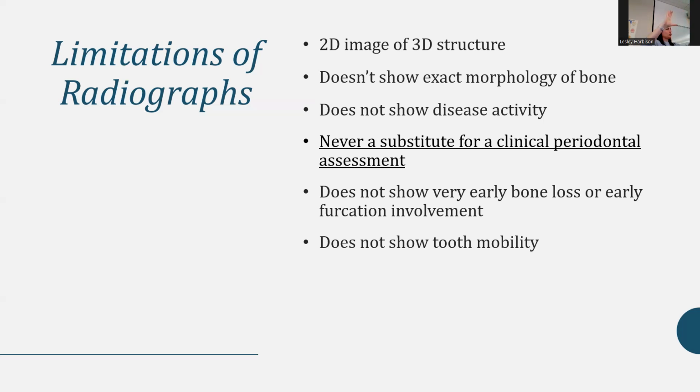You have the crown of the tooth, then the space that's solid, and then the division into the roots, and that can be short on some people or long on others. Does she call it the neck? I don't know what she calls it, but I kind of call it the trunk. So if somebody has just a little bit of bone loss, you can start to feel the very tippy top of the furcation. And if you run your probe sideways, you can just feel a little indent.